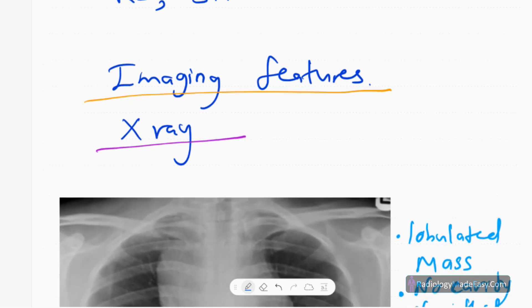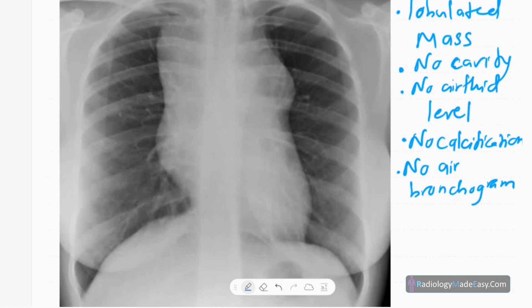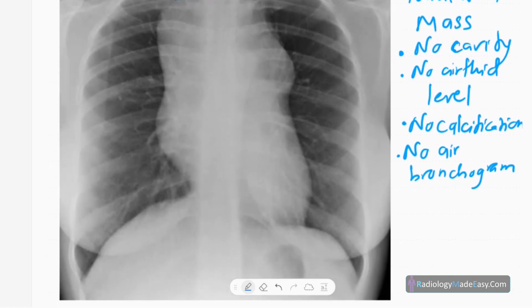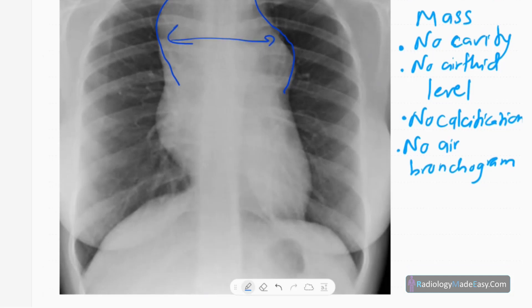In this video, our main aim is to describe the imaging features of lymphoma. Starting with the X-ray, this is a frontal chest radiograph. Here you can see a superior mediastinal widening with lobulated outline. There are no air-fluid levels, no air bronchograms, no calcification, and no cavitation. The lung fields appear normal.